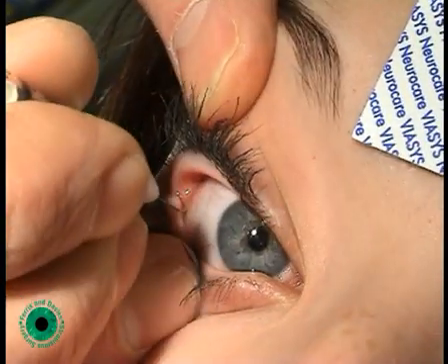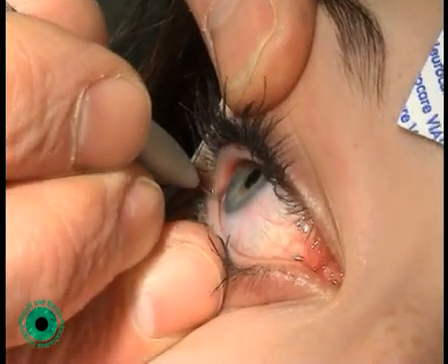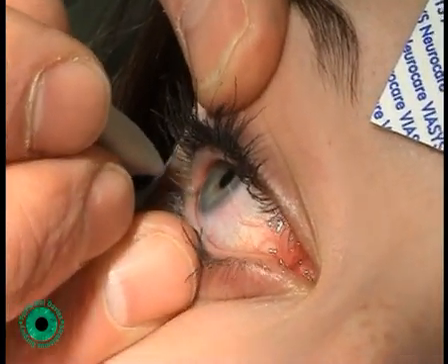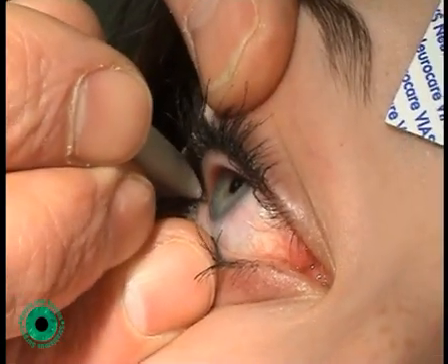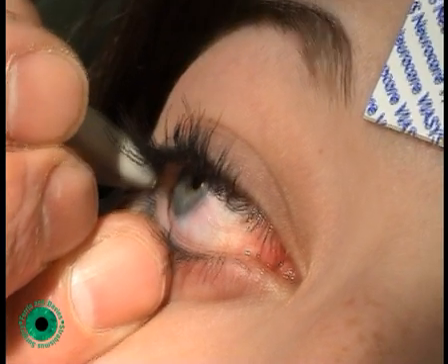Once the conjunctiva has been breached, the patient is asked to look to the right. The orientation of the needle is then altered, so the needle shaft passes backwards and medially along the path of the lateral rectus.